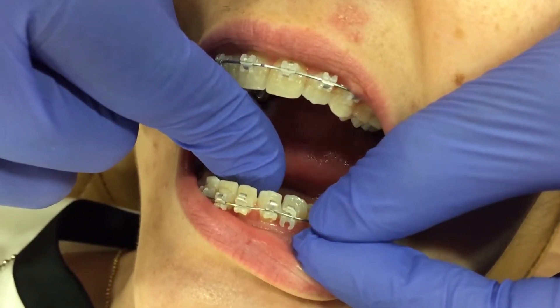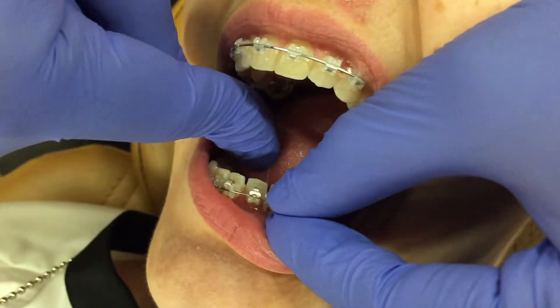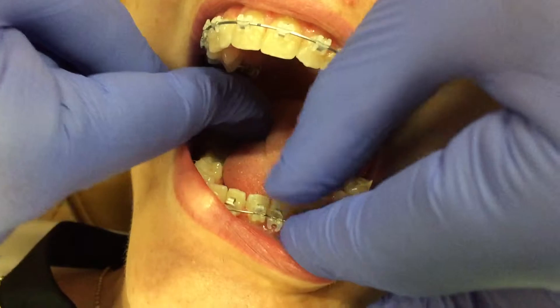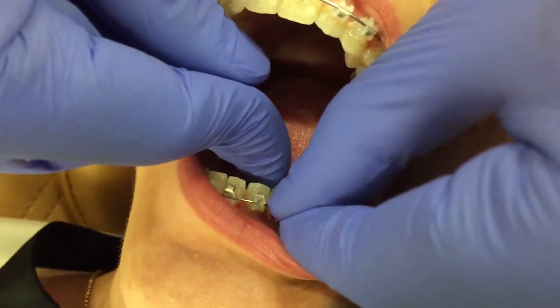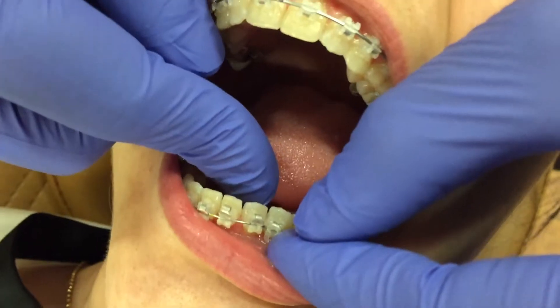If we want to engage this tooth, just pull the floss until the tooth and the wire are fully engaged, and then you can close the gate like so.